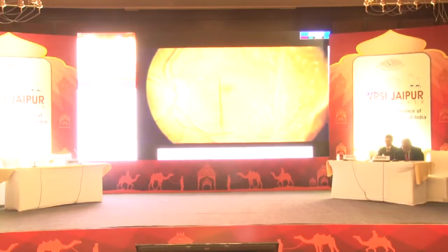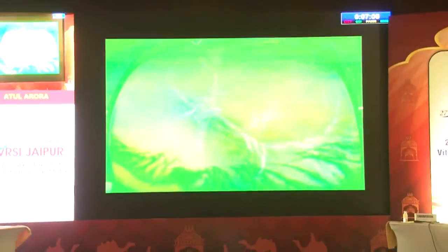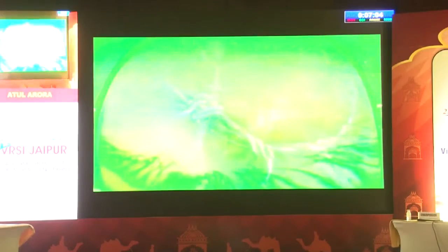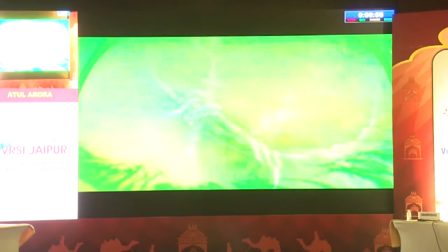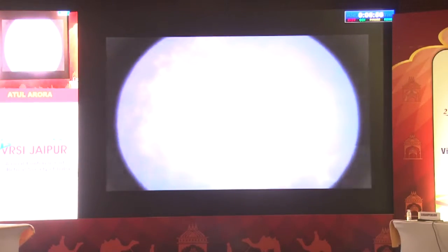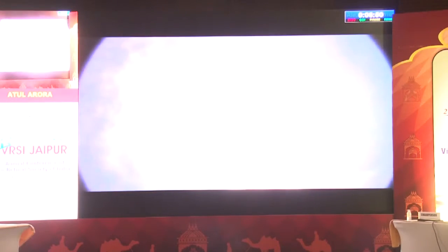Pediatric retinal detachments present many inherent management challenges, including late presentation, bilateral involvement, poor correlation of functional and anatomical outcomes, and the need for a prolonged follow-up for visual rehabilitation. Examination under anesthesia is often recommended for detailed preoperative evaluation and surgical planning. In this video, we describe the surgical principles for management of such patients of complex pediatric retinal detachment.